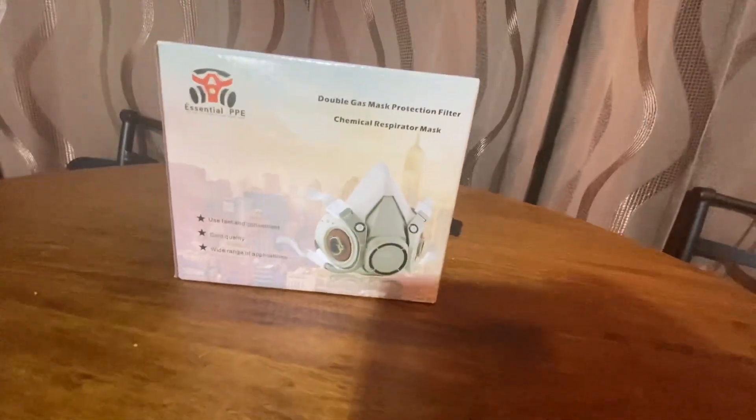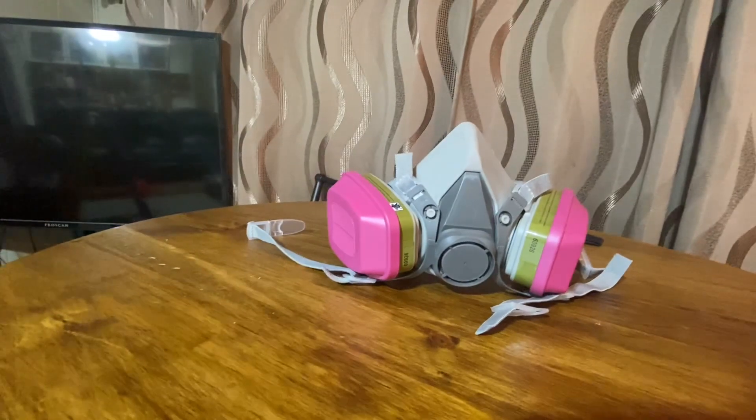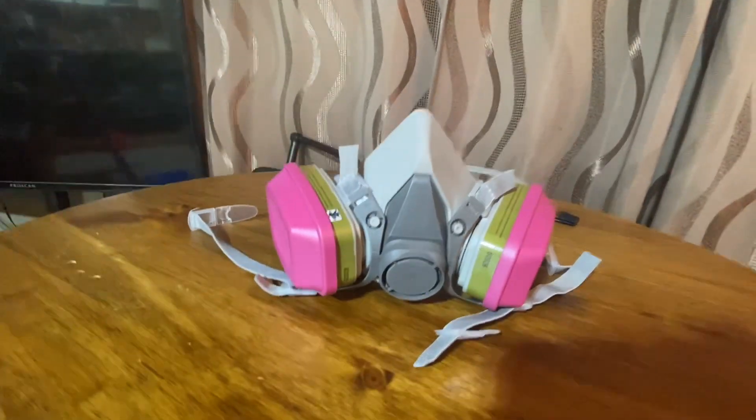This half-face respirator mask is equipped with the latest 60926 filter cartridge. This provides stronger filtration performance.